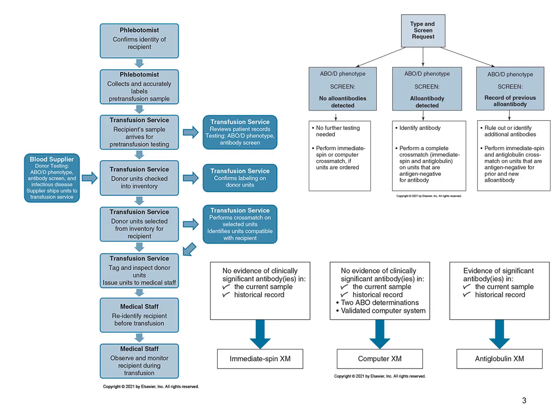Okay, so this is a pretty busy page here, so let's run through this to see the various steps that happen within the transfusion world when an order is placed for blood or blood products for a patient. So first off, the first step that's going to happen is the sample has to be collected.